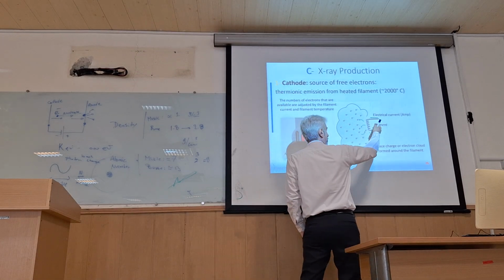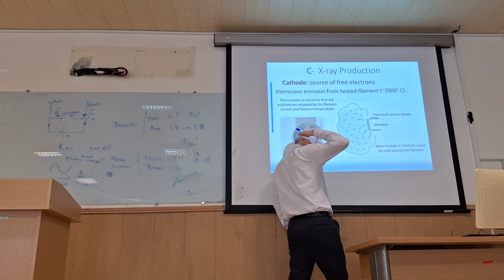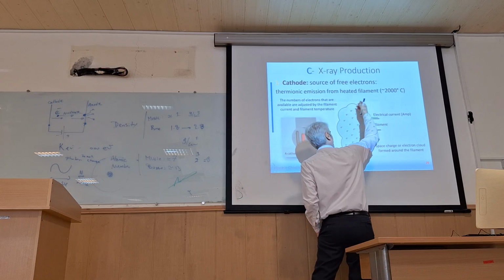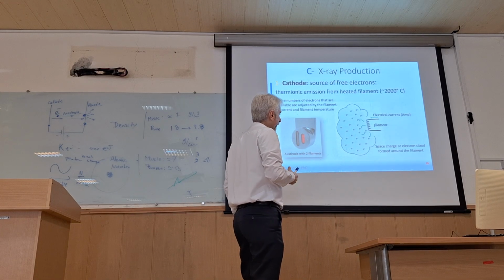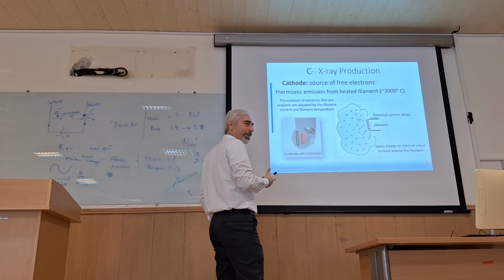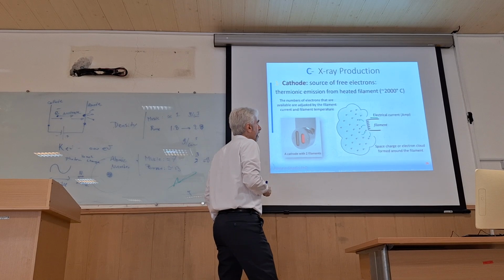The free electrons inside the filament get energy and go around the filament, and so we have free electrons ready here to accelerate.